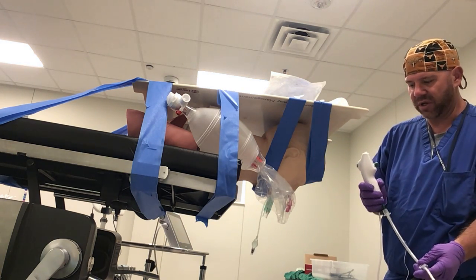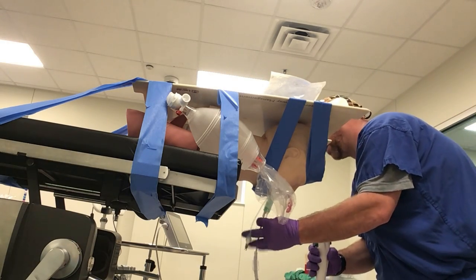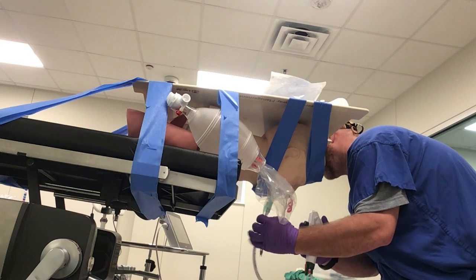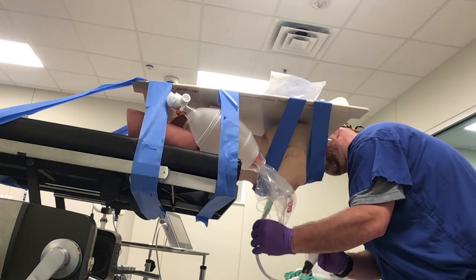I've preloaded the endotracheal tube onto my scope, just inserting it. The other nice thing about using an LMA versus the Glidescope device is that your positioning is not quite as important. Slide the scope into the trachea. The scope's inside the trachea, I'm happy with my positioning, and then I just feed my tube in.